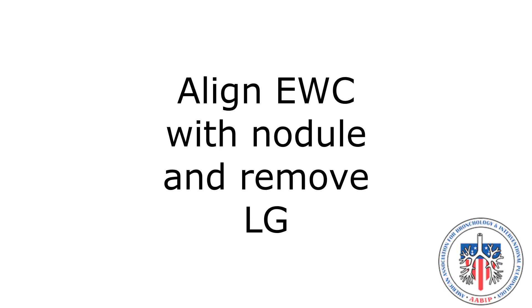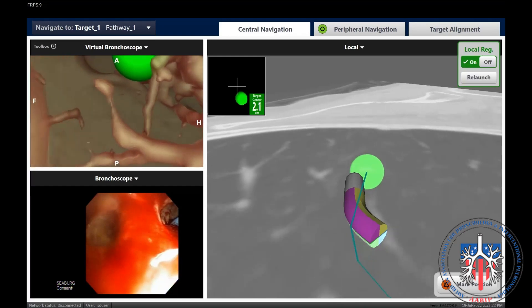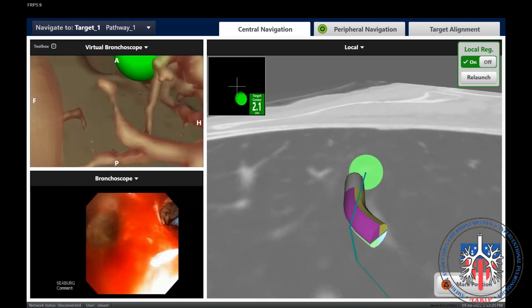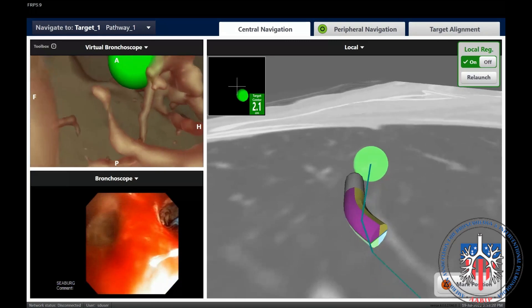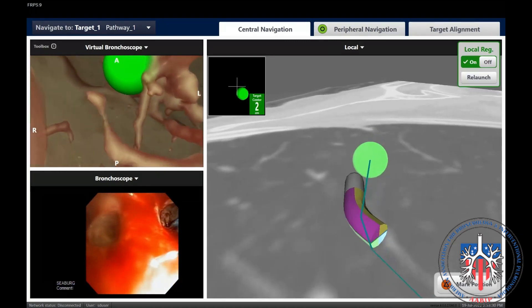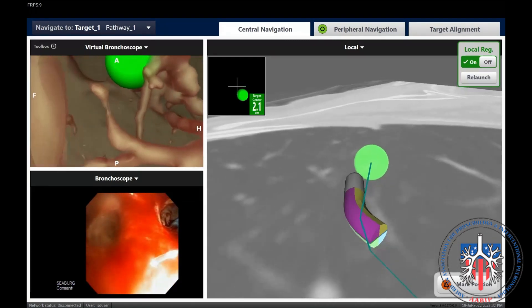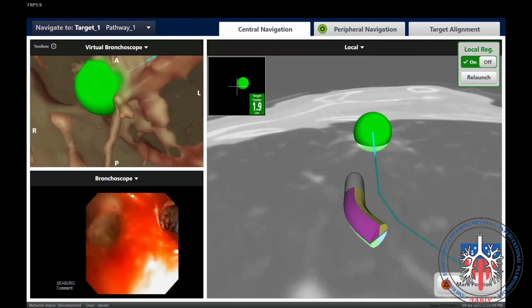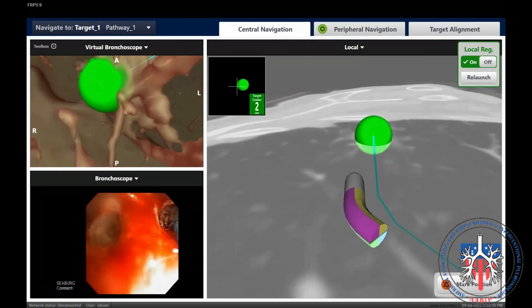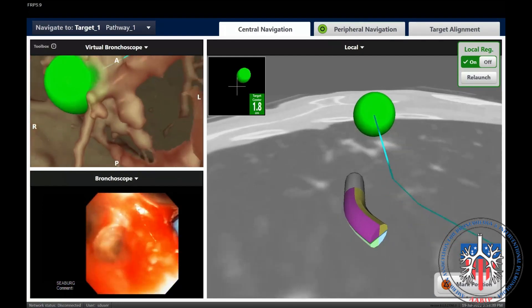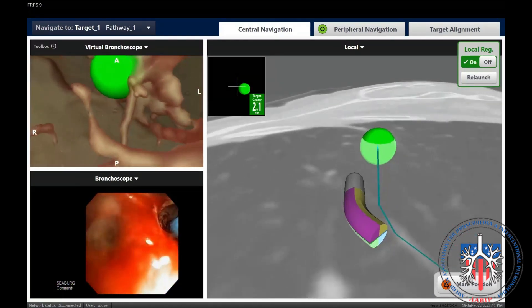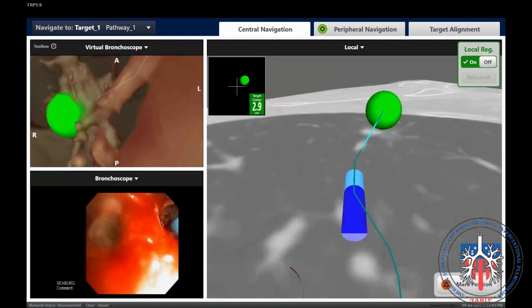Align the extended working channel with the nodule and remove the locatable guide. After updating the location of the nodule using fluoroscopic tomosynthesis, the next step is to realign the navigation catheter with the nodule and remove the locatable guide, leaving the extended working channel in place. When this happens, the extended working channel symbol will turn blue on the navigation screen.